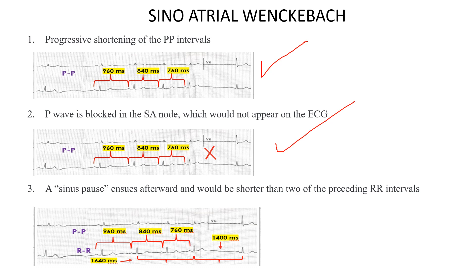Third, the sinus pause that follows would be shorter than two of the preceding PP intervals. Looking at the two preceding PP intervals, the pause is shorter — approximately 240 milliseconds shorter — which is a significant difference. This criterion is also met. This ECG fulfills all criteria for sinoatrial Wenckebach.